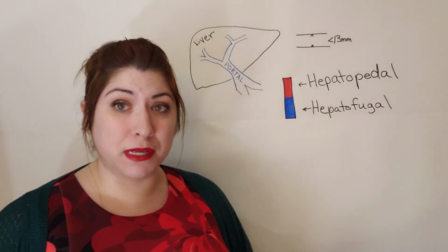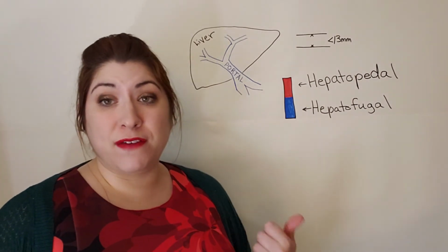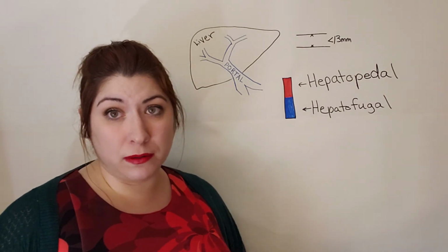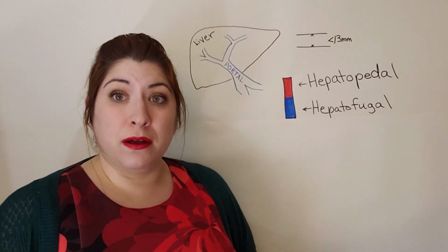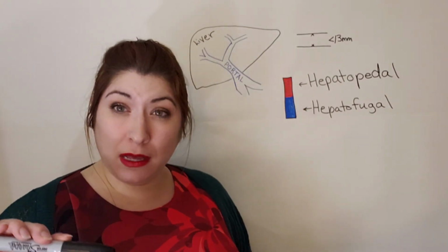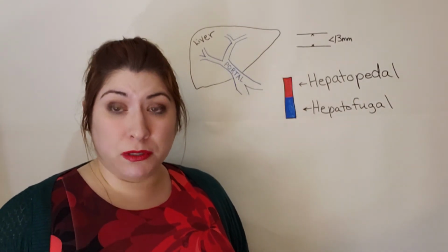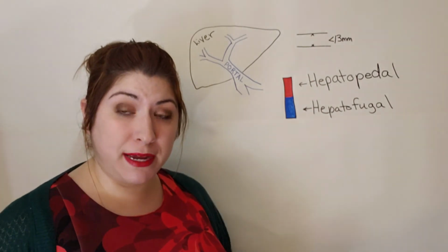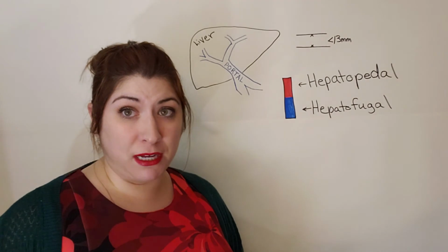The second thing is that you're using correct technique. If your probe is backwards, it's going to make the flow appear backwards. So if you are getting your nice long portal vein image more transversely, you want the notch to be towards the patient's right side. If you're getting it more in a sagittal plane, your notch should be towards the patient's head.